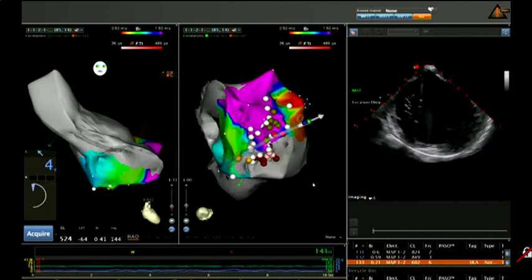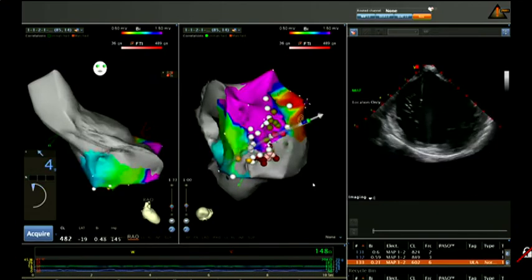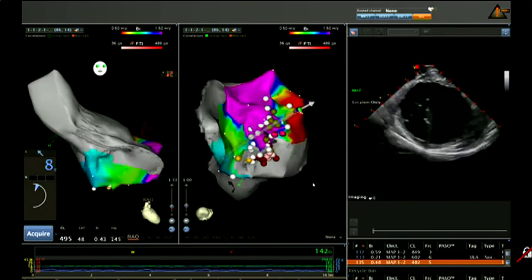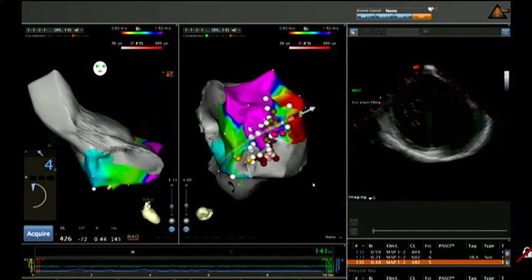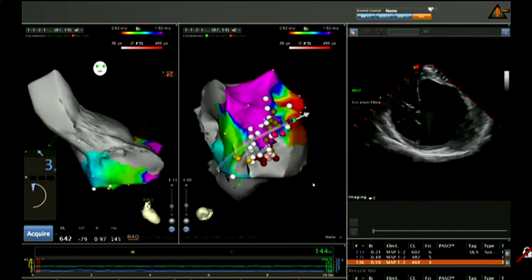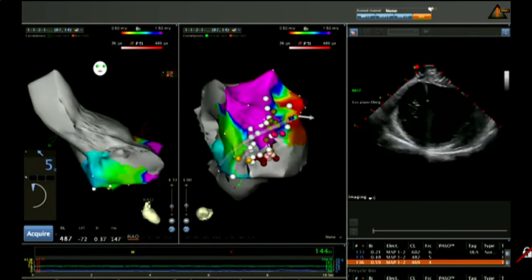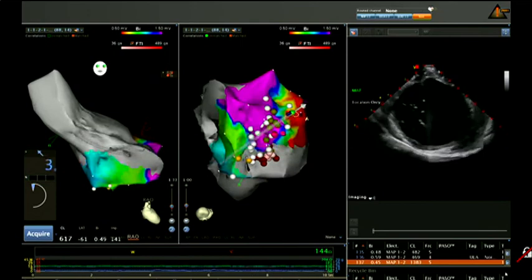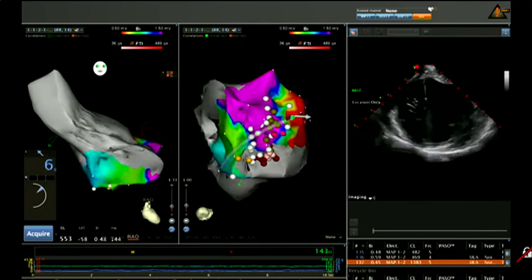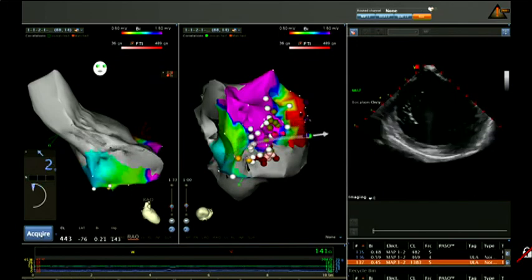Maybe the problem now is that the patient is in sinus rhythm, but the morphology is changing. We don't know if it's an effect produced by dobutamine, but it suggests that maybe we are dealing with PVCs coming intramurally with different exits.